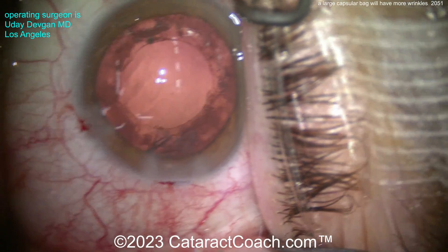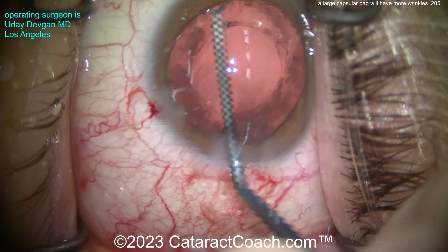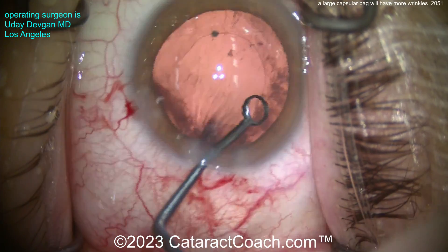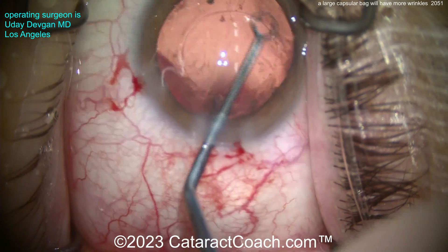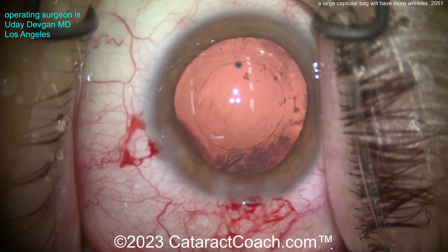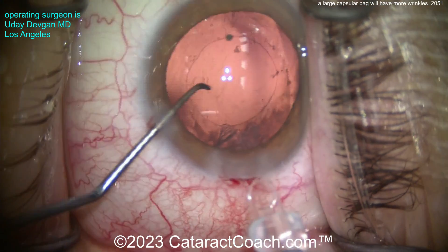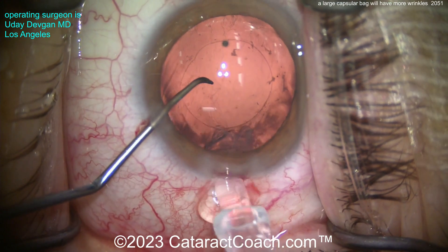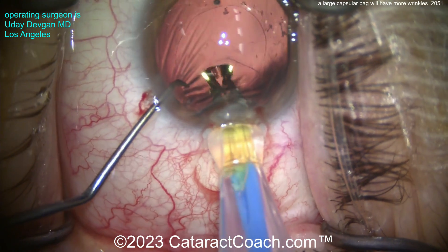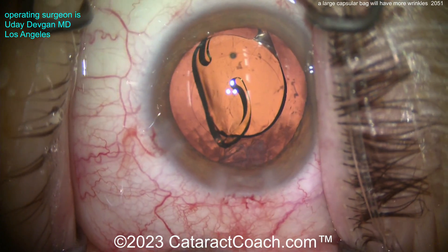This next patient is also highly myopic with a big eye and big capsular bag. The eye is full of viscoelastic. We took the cataract out and we're polishing up the undersurface of the anterior capsular rim — a little capsule polishing, being very gentle. This patient has a low dioptric power, but this time it's still a plus power, and the lens is not a meniscus design — it's a regular design. It's actually a one-piece lens. As this one-piece lens goes in the eye, you'll see it's a lot easier to get into position.